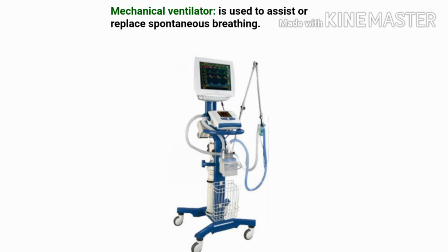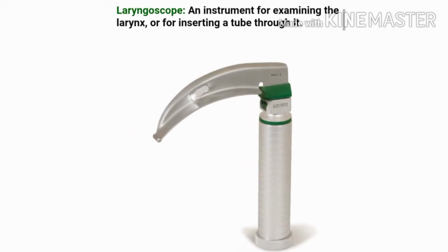So let's see our next image, which is a laryngoscope. As you can see the image very clearly, a laryngoscope is an instrument for examining the larynx or to insert a tube through it. Tube means you can insert an endotracheal tube with the help of a laryngoscope.